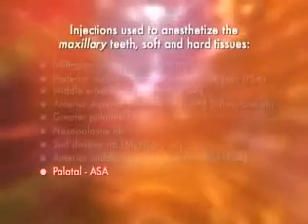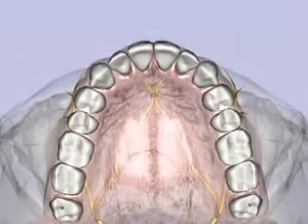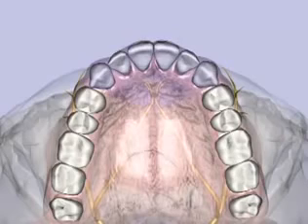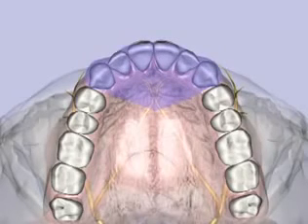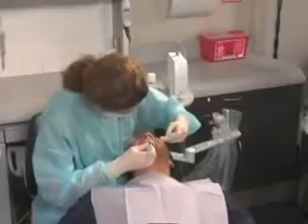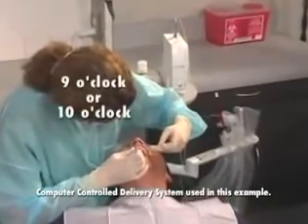The palatal approach to the anterior superior alveolar nerve block, also called the PASA, provides pulpal anesthesia bilaterally to the maxillary incisors and to a lesser degree the maxillary canines, as well as the labial and palatal soft and hard tissues of these teeth. For the PASA nerve block, sit at the 9 or 10 o'clock position facing in the same direction as the patient.